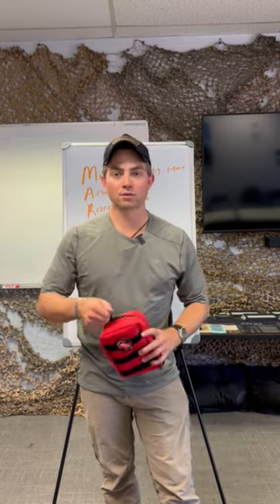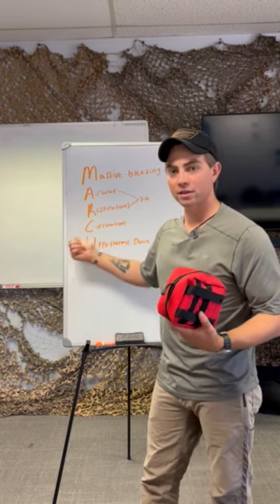Right, so if you're building out, whether it's a small on-the-body kit to a massive professional med bag, you should be staging it in accordance with the precedence of what is going to kill your patient the fastest.